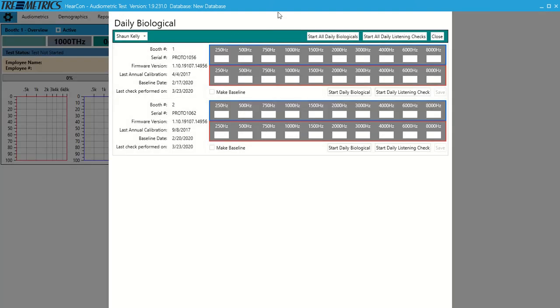Here we can start our daily bios if we want. We can start all listening checks. We can run all those daily procedural checks.